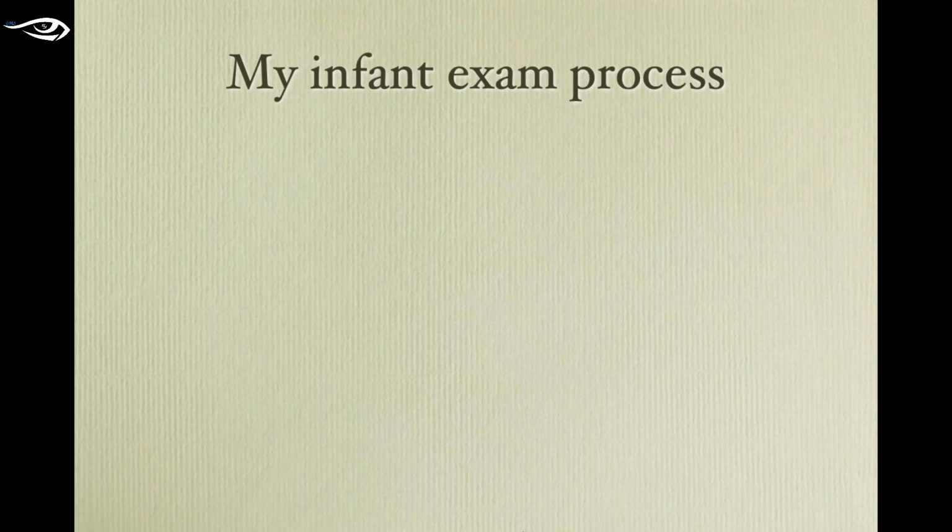So I bring the patient and mom into the exam room. I'm doing my observation. I am taking a history simultaneously. I pick up my ophthalmoscope. I do Brückner. I put the ophthalmoscope down after I've done Brückner and I've done pupils. I've also done a cursory examination of the anterior segment using the ophthalmoscope.